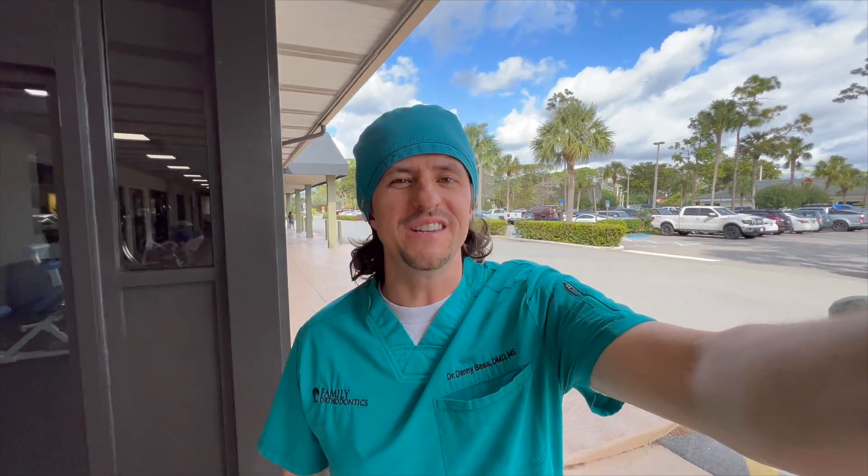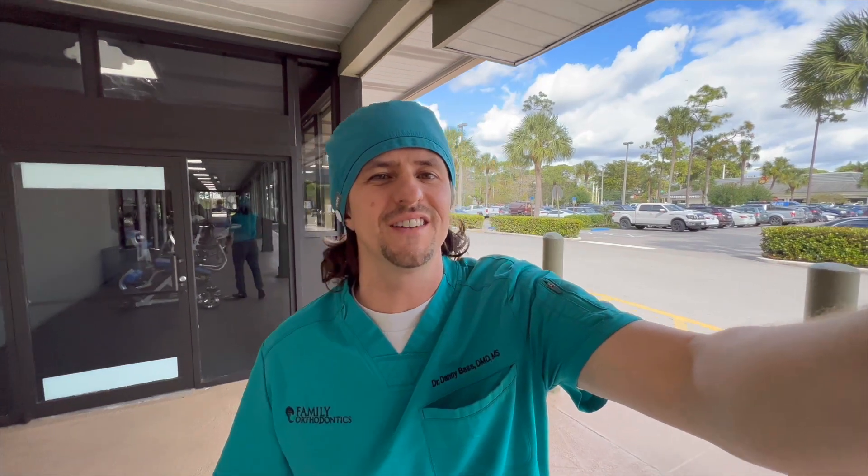Well, howdy y'all. I am Dr. Danny Bass, orthodontist and owner of Family Orthodontics of Wellington. Today I am super excited to share with you an amazing case from a patient of mine that we treated — his skeletal class 3 malocclusion using the non-surgical MU technique.